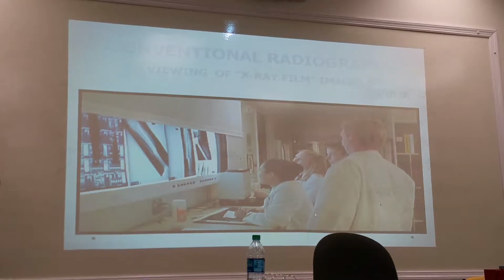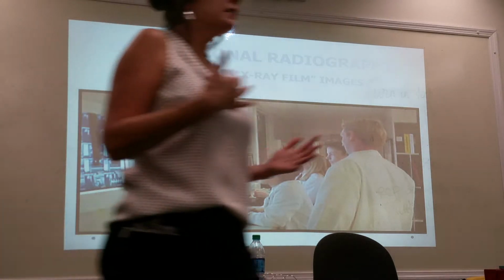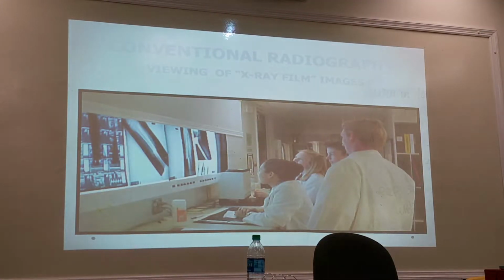Using digital radiography, computed radiography. Right now, everybody, it's two terms. Computed radiography is when you're using the imaging plate in a reader, and then digital radiography refers to the detector being incorporated in the equipment like we have in the front room. Okay, so that's where we're at the moment.